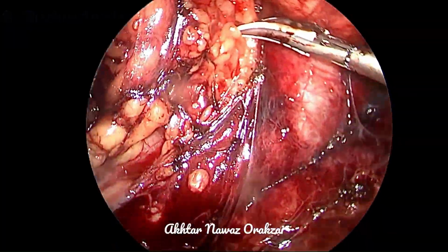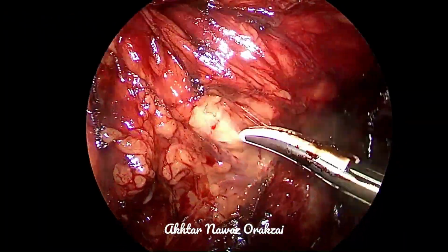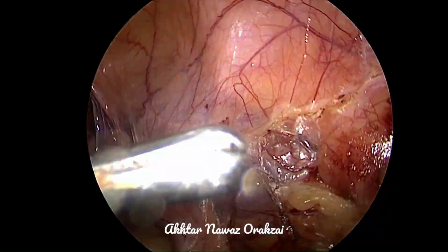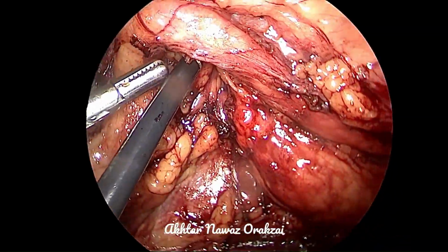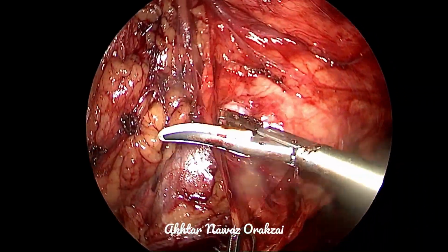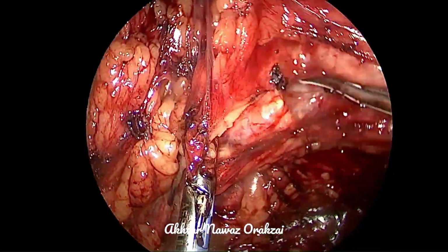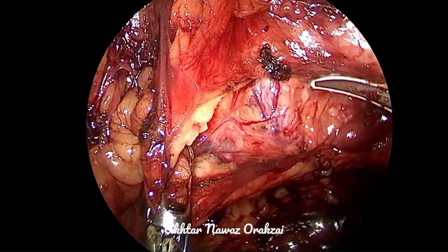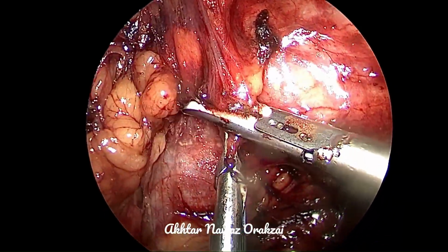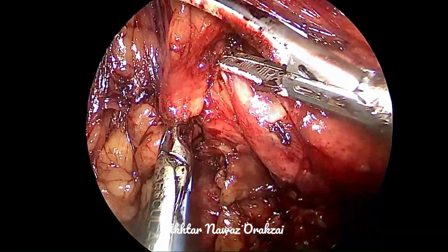Reduction pelvioplasty is not a principle. However, they say that if there is a huge pelvis, it is better to reduce it, because at times the huge pelvis in itself compresses against the structures and gets obstructed. And usually the huge pelvis is also hypotonic, so the volume of the pelvis may be reduced. This is for the crossing vessels, which are causing external compression on the pelviureteric junction.